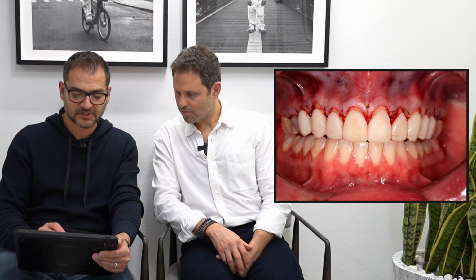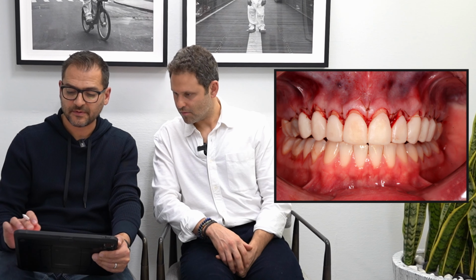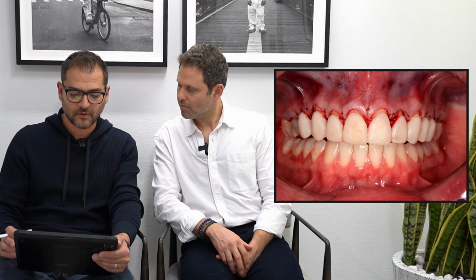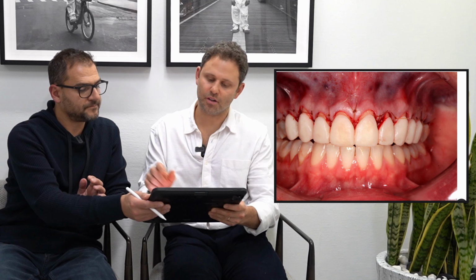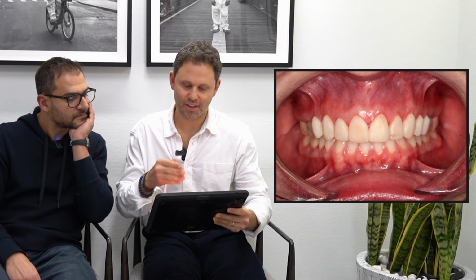At this point, the patient was asked to return in 2 weeks to have a look. These stitches actually all dissolved. They didn't have to be removed. And she's going to return to Dr. Alex in about 6 weeks in order for all this tissue to finally mature enough so that he can start his next process.